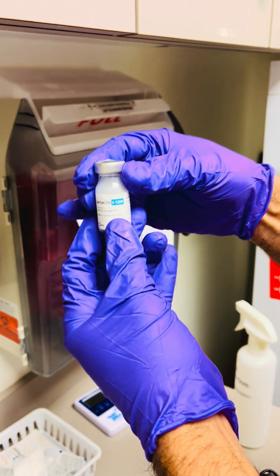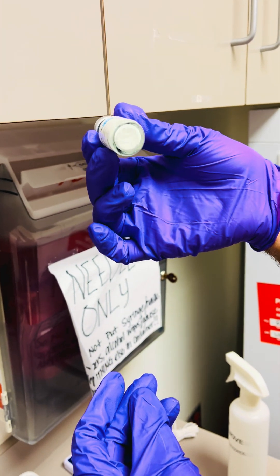When the powder goes into solution, it'll have a milky white appearance to it.